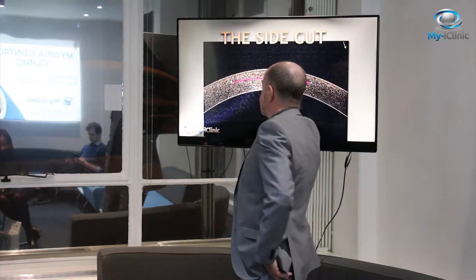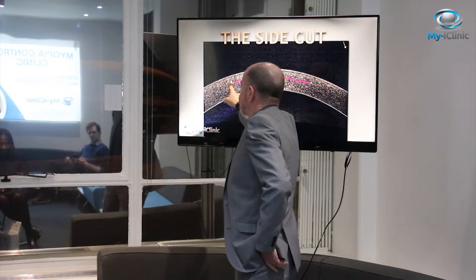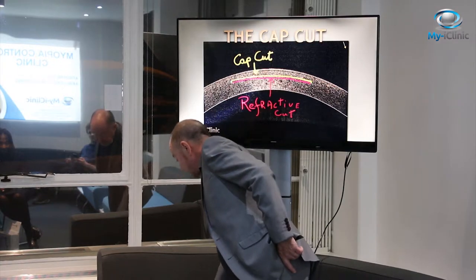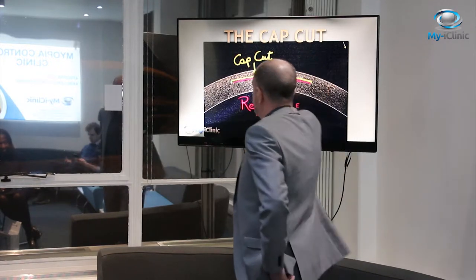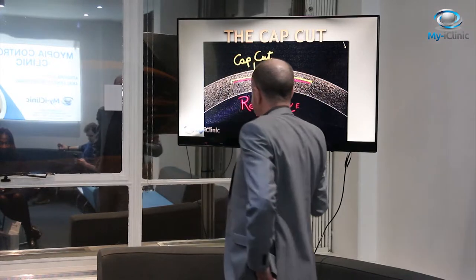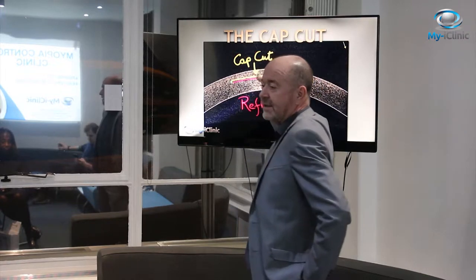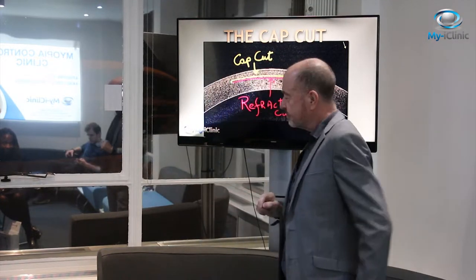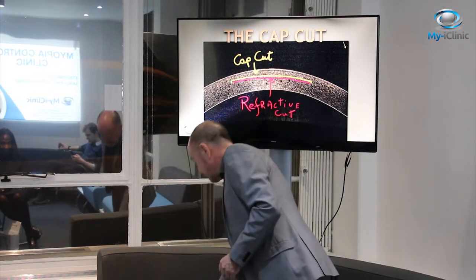The next cut is two side cuts. Remember this is in 3D — this is a disc, a circle — so you can see it cuts up towards the epithelium. Then the third cut is the cap cut, which is just the anterior part, joining the sections together. And the fourth cut is just a small nick, usually two to four millimeters in length, through which the excess lenticule is removed. This whole process is all within the stroma of the cornea.